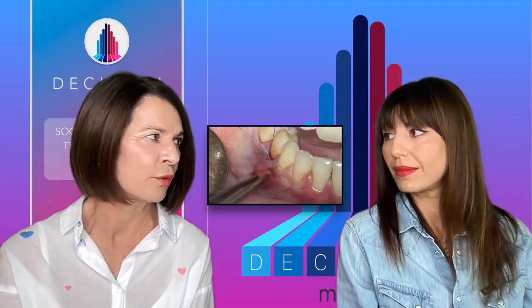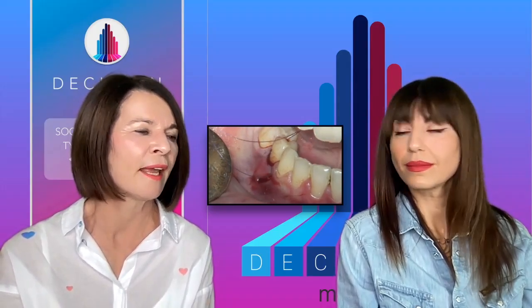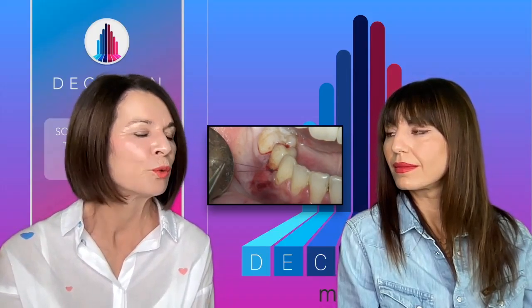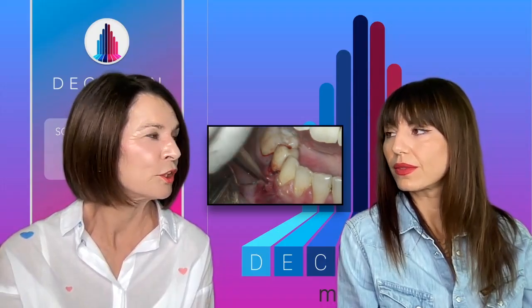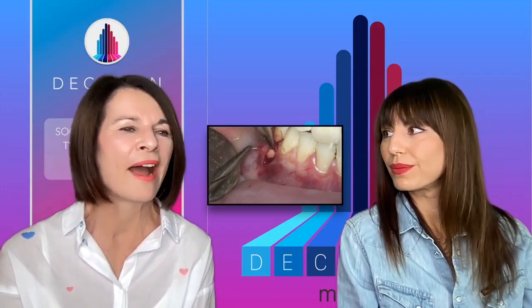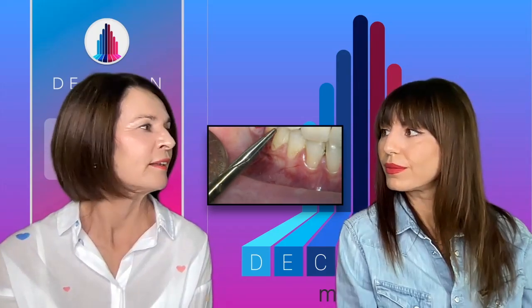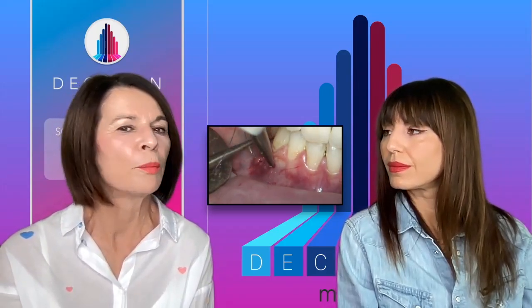And here I don't go through the sulcus of the implant. I always apply the VISTA technique, and it is really a very handy and nice way to improve the peri-implant soft tissue. I often combine approach from the sulcus and from the vertical incision in order to mobilize the flap.